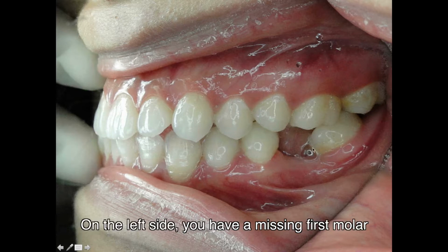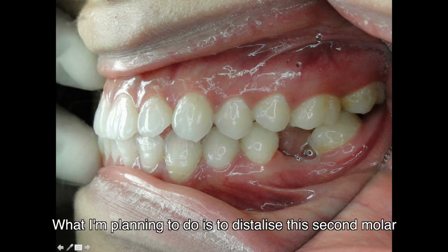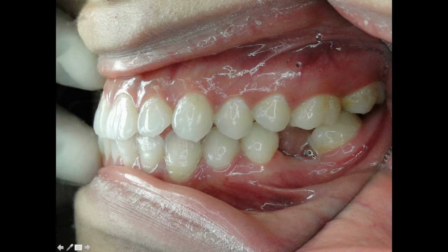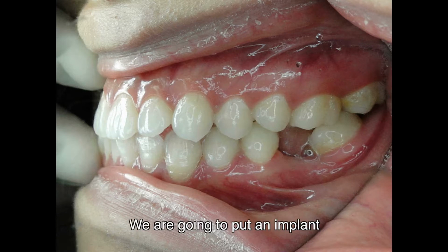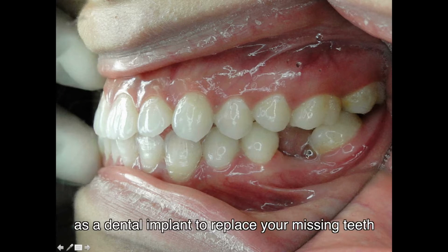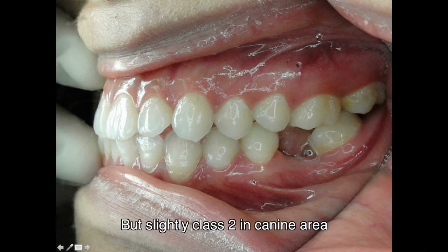The left side, you have a missing first molar. Don't worry, we will do something about it. What I'm planning to do is to distalize this second molar so that you have proper size first molar. How do we replace it? We're going to put an implant. We're going to put a proper size first molar in this region here as a dental implant, to replace your missing teeth. Notice this side, you are class 1 situation, but slightly class 2 in canine area.